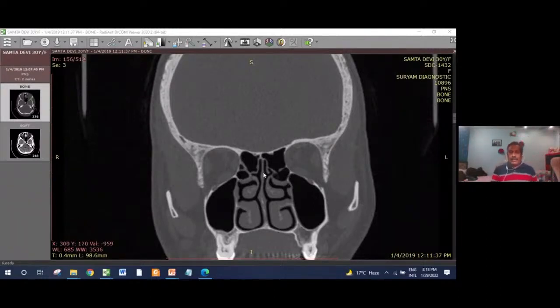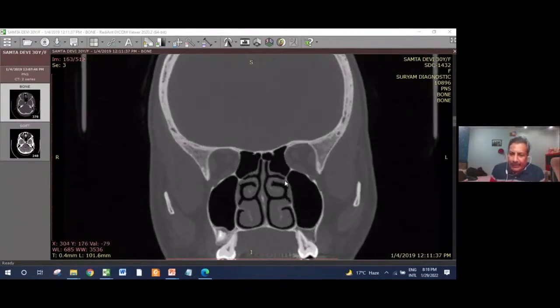And this is very important to keep in mind while working in the postethmoidal cavity, to stay safe, to stay medially, more and more medially, and laterally is the critical. While working in the frontal sinus, you are advised to stay more laterally in the frontal recess to avoid damage to the skull base. Here, while working in this region, you are advised to stay more medially close to the superior turbinate to prevent damage to the posterior part of the orbit. So everything is important. Now, as you go behind, what is important?